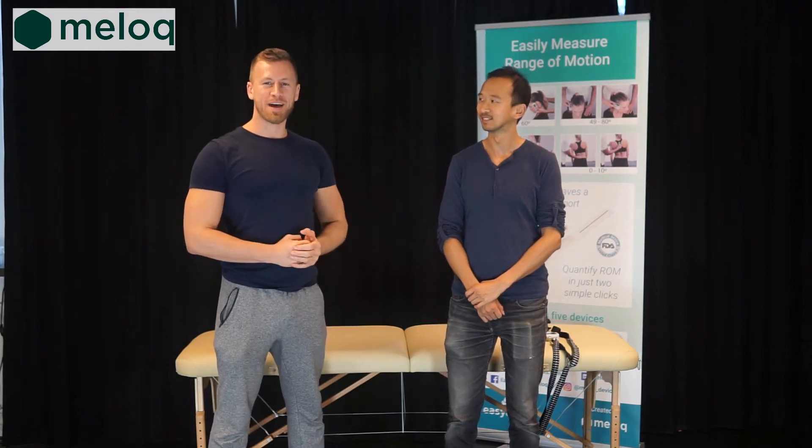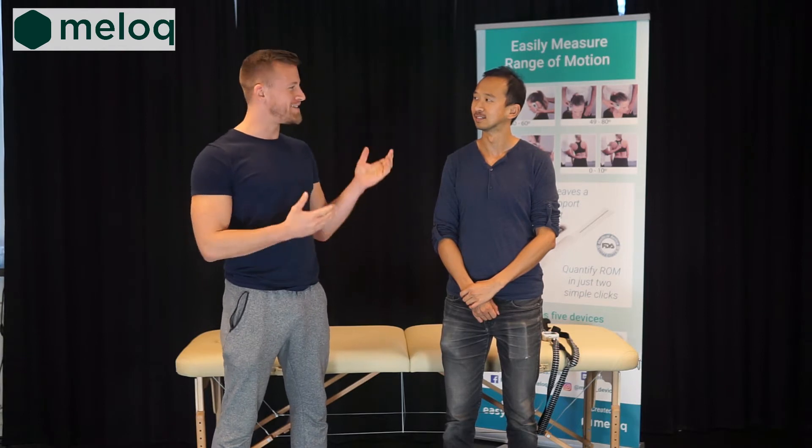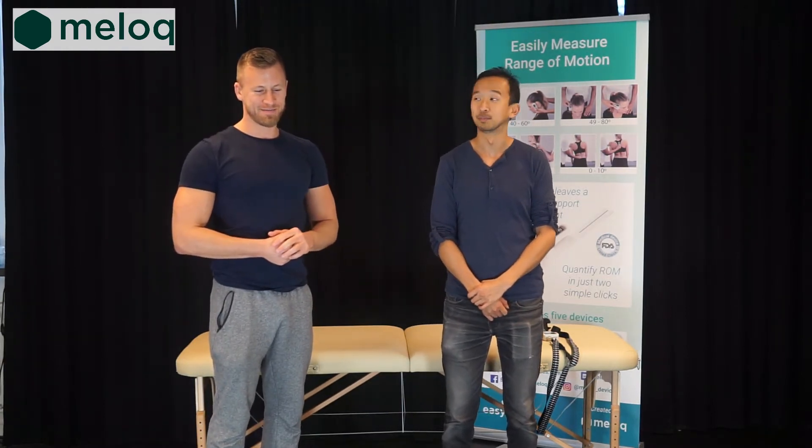Hi everyone, my name is Marko. I am a physiotherapist and a clinical advisor at Meloq. My name is Ray, I am one of the co-founders, but today the focus is on the patients.